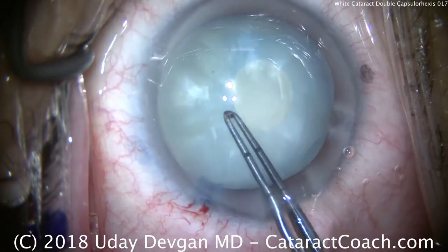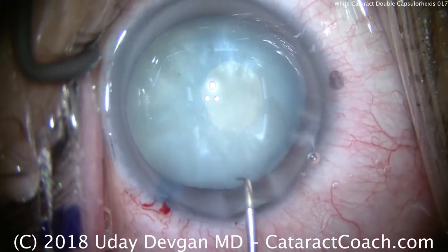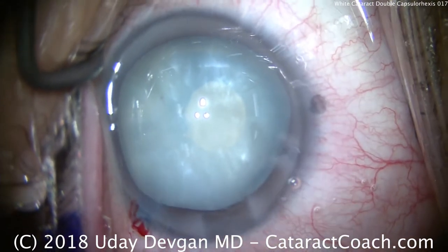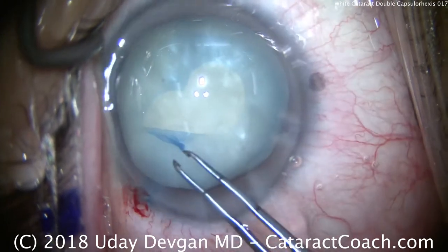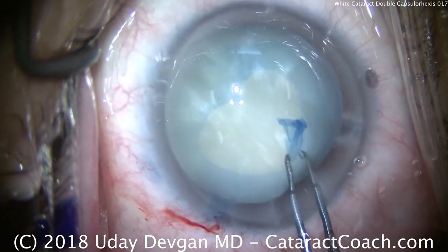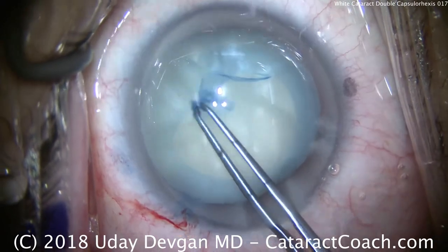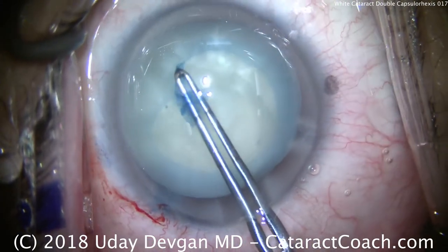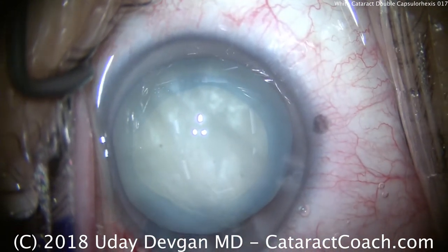We're going to try to enlarge this rexis now by grabbing it. The forceps weren't sharp enough, so we'll use a cystotome to make a nick here in the capsule. Now let's go back to the capsulorexis forceps — these forceps are marked off at two and a half and five millimeters from the tip. So now we can tear our normal capsulorexis, which will encompass the initial small baby rexis, and we can complete it. It doesn't have the risk of radializing like before because the whole capsular bag has been depressurized. Now that's a nice, round, sufficiently large capsulorexis.